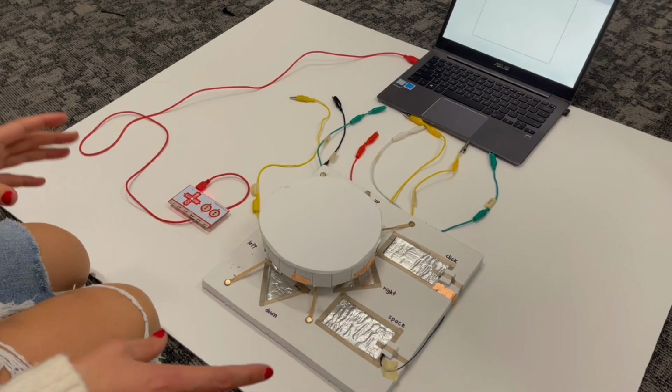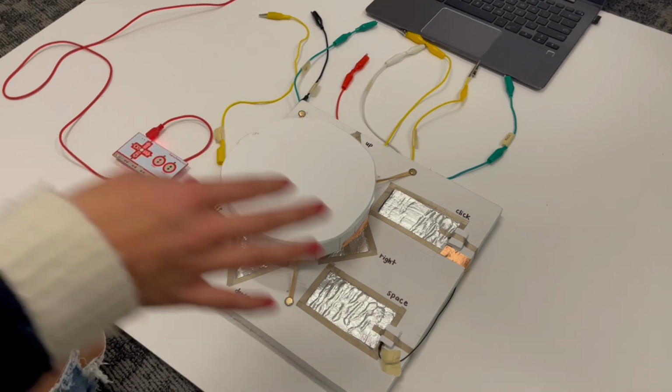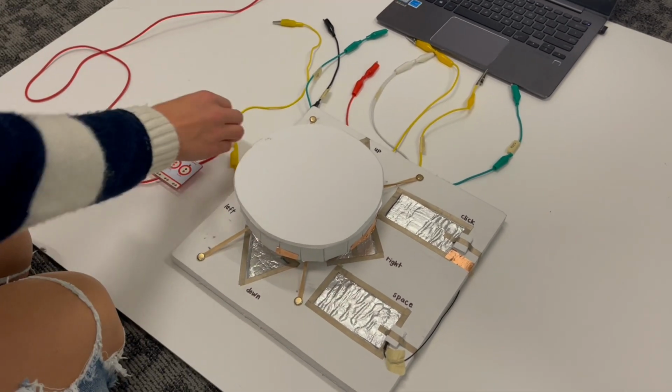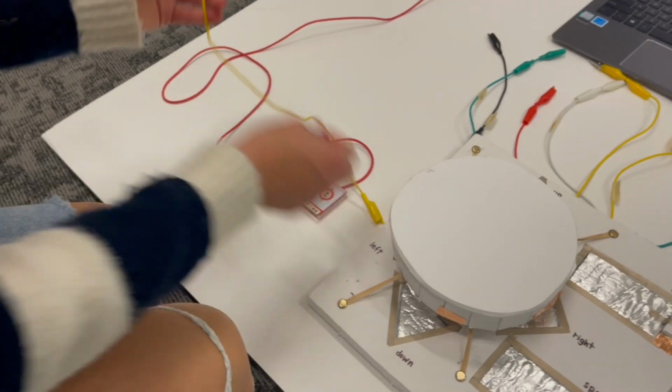So this is the Diplegia add-on. Here you have the up, down, right, left, click, and space arrow keys. You're gonna start by connecting them onto the makey, and they're all labeled for convenience.